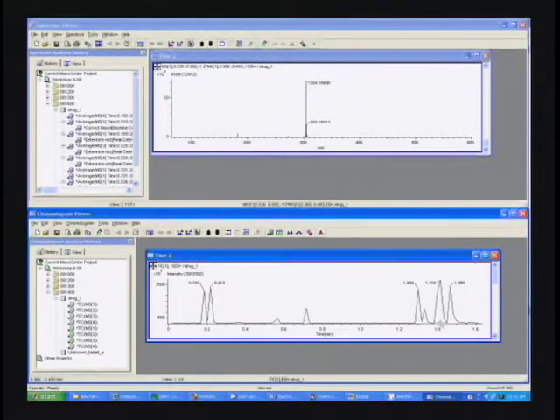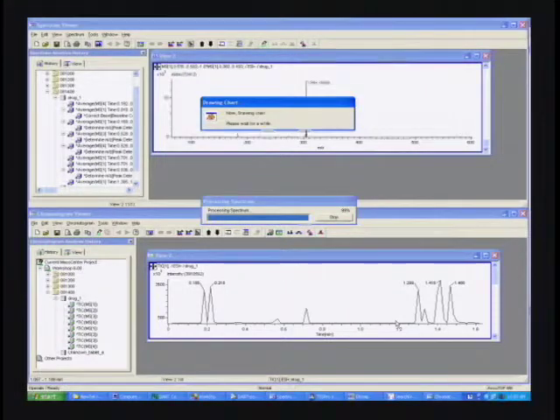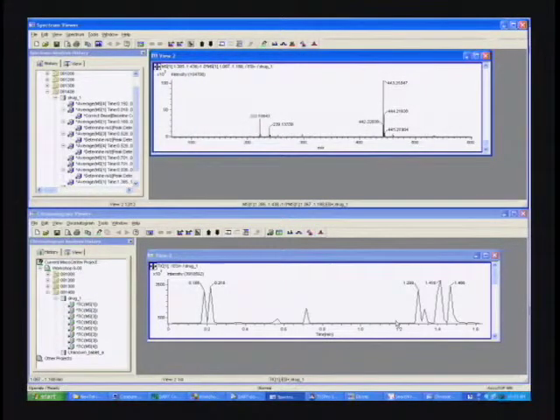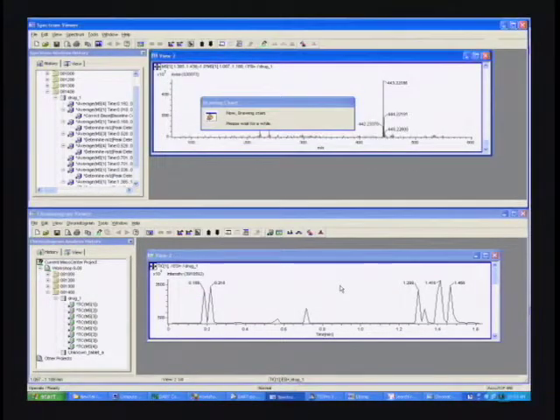So now here we are at the 20 volt function, and we're going to take one of the sample peaks that we ran of the drug unknown, and we'll take the averaged background subtracted spectrum of that, and this is what it looks like here. We've already applied all of our calibrations to that. We merely need to centroid this data, and we'll have all of our calibrations applied.